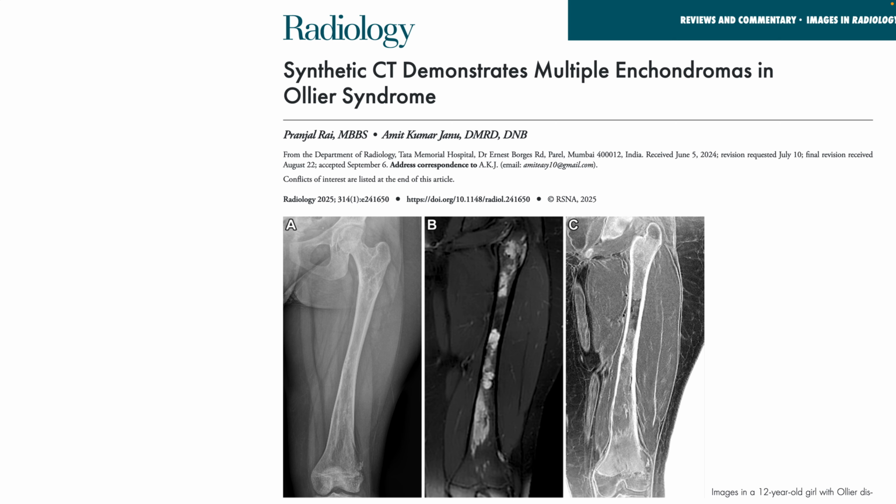And then earlier this year, Amit and Pranjal published this paper in Radiology. Big deal, right? Getting published in Radiology. And they showed this Ollier's case, which was beautifully seen on this UTE image.